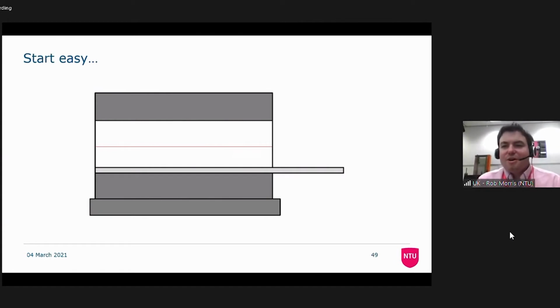To work out what happens next, I want to start off with our simple example, and we're going to take our MRI scanner and put into it 3 discs which are meant to be infinitesimally thin, so thin that they've got a single proton of water in. Obviously that would give us no signal, so somewhere in between a kind of fat disc and a normal disc will allow us to see better what's going on.